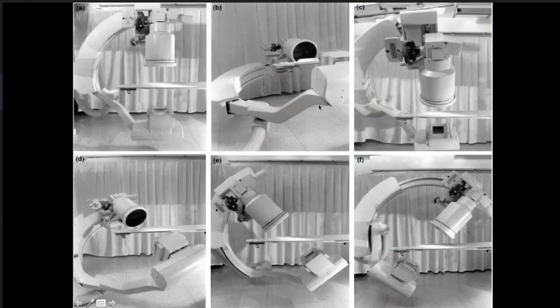Now, the modern cath labs, I think you're all familiar. Quickly going through it, we have an X-ray source here and an image intensifier here, and the patient lies on the table. Therefore, this is the view for an anteroposterior or frontal view. You turn it around. In modern machines, you don't move the patient. When we learned cardiology, the tube was fixed and the patient had to be rotated. But now the machine rotates. So this is the lateral projection.